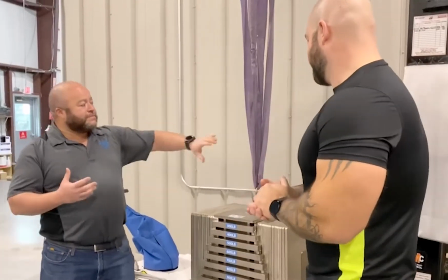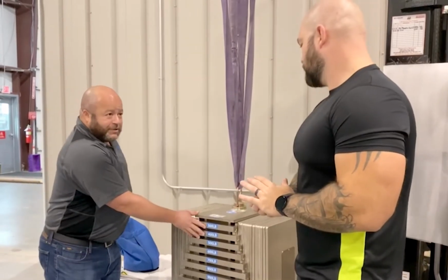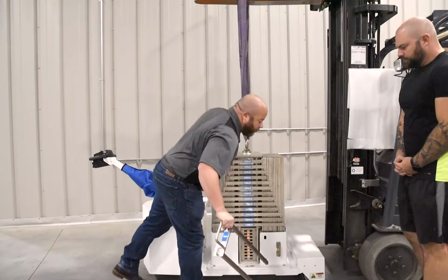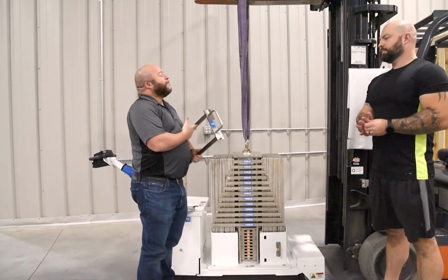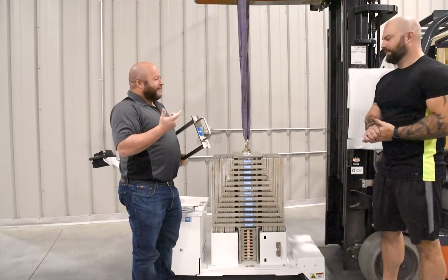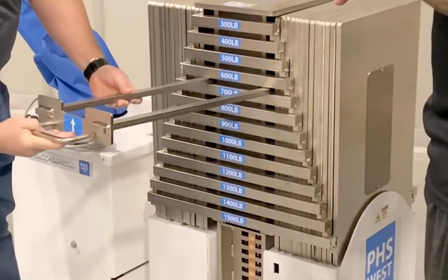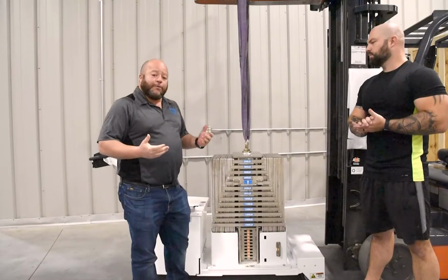Simple solution: you hook up your sling to your ceiling lift. With this particular setup, you can grab one of your weight bars, very much like, and Nate, I'm sure you're probably familiar with this analogy, very much like the pulley systems that you see at the gyms. Oh, definitely, yeah. All you have to do is simply insert whatever particular weight you need to test, and now we're ready to go.